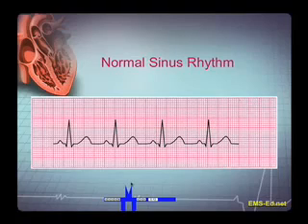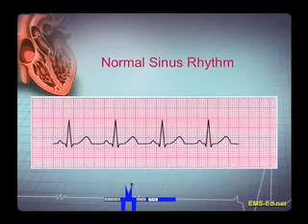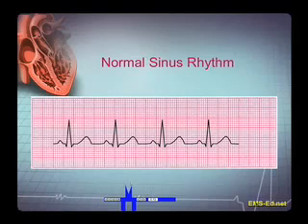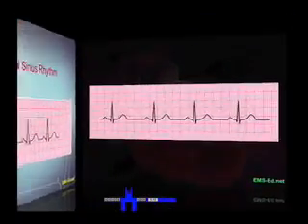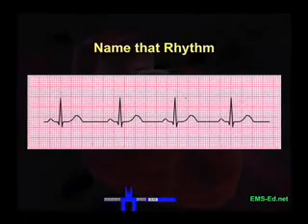Next we will look at some basic dysrhythmias. I will give you about 30 seconds to name that rhythm before I give you my analysis. We'll play music to liven it up, and also to distract you. So let's begin. Name that rhythm.